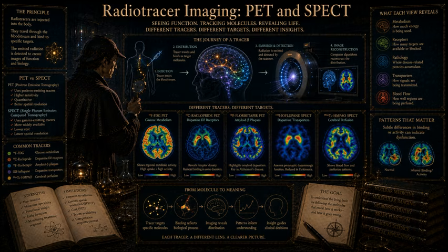This is where we return to your displacement analogy, where the endogenous neurotransmitter acts as the VIP towing the tracer car out of the spot. To measure release, we use highly clever dynamic experimental designs called pharmacological challenges. The most famous and illuminating of these is the amphetamine challenge. Walk me through exactly what happens to a patient undergoing an amphetamine challenge study, step by step.